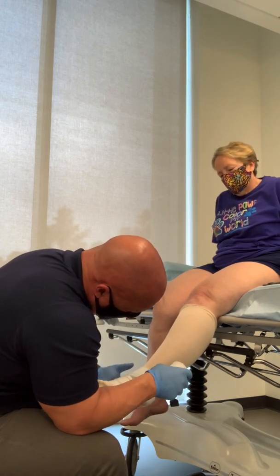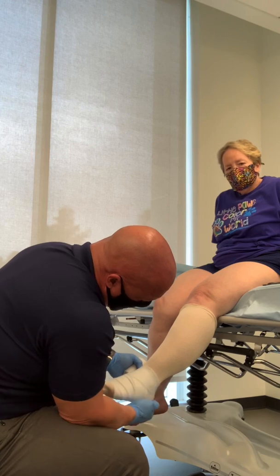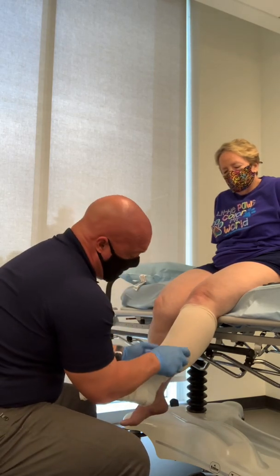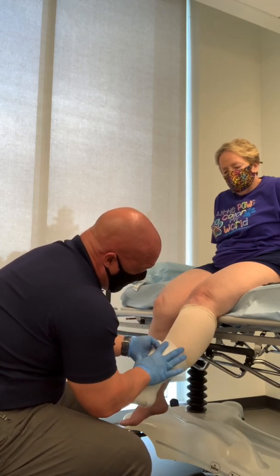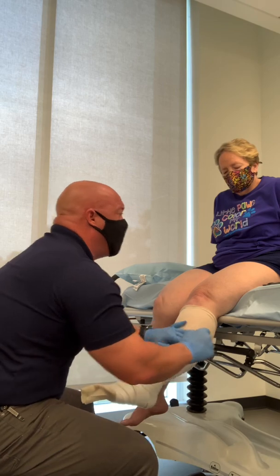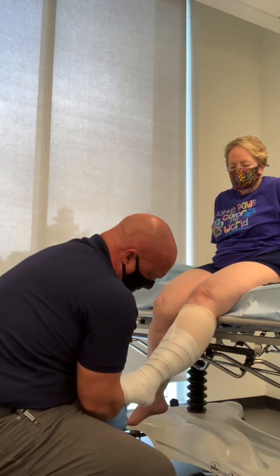When you get to the heel, cover the heel, then take your next pull, come around the foot and then around the top of the heel, so the heel is completely covered. Then continue wrapping up. You want just enough tension to cover the leg nice and flat, but you don't want to push any tension down into the leg at all. You also want to double the padding if possible — especially on something that may be toe-touch weight bearing. Starting where I began before, I'm going to put in a second layer.